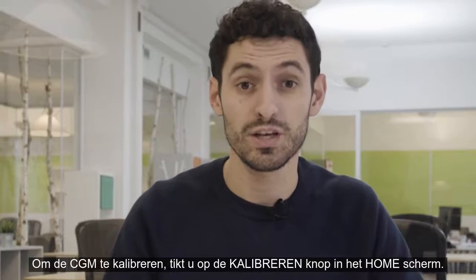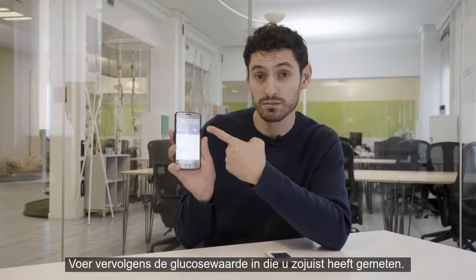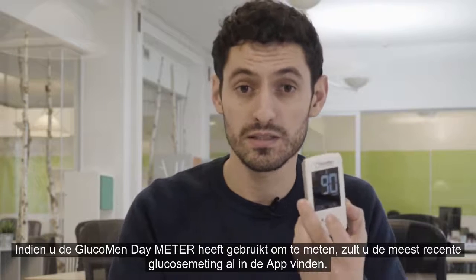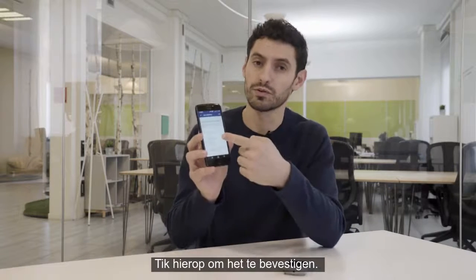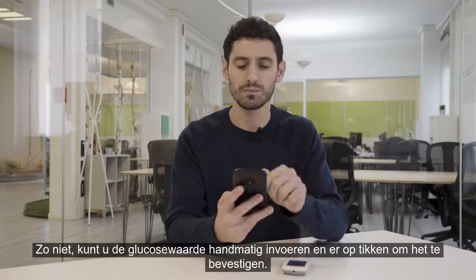To calibrate the CGM, just tap the calibrate button on the home screen, then enter the glucose meter value you just measured. If you used the Glucomendae meter to test, you will find the last blood glucose measurement taken already in the app. Tap it to confirm; otherwise you can enter the glucose value manually and tap it to confirm.